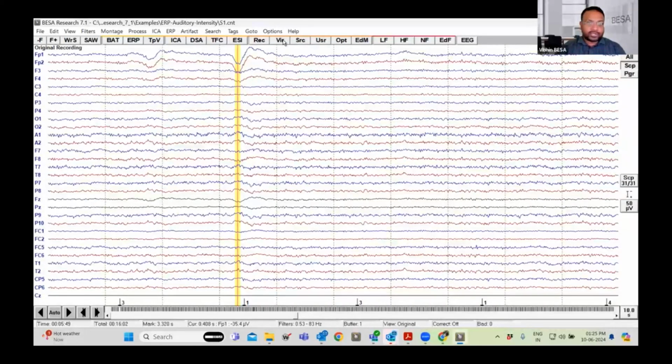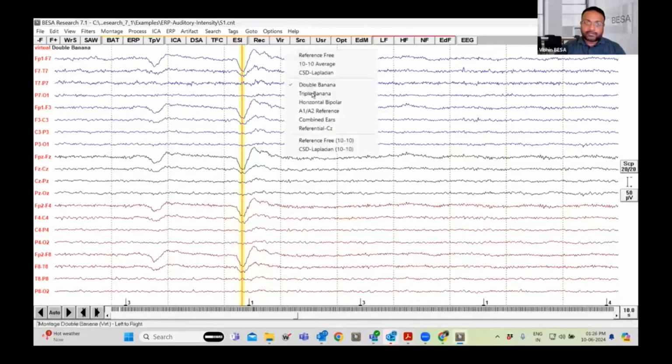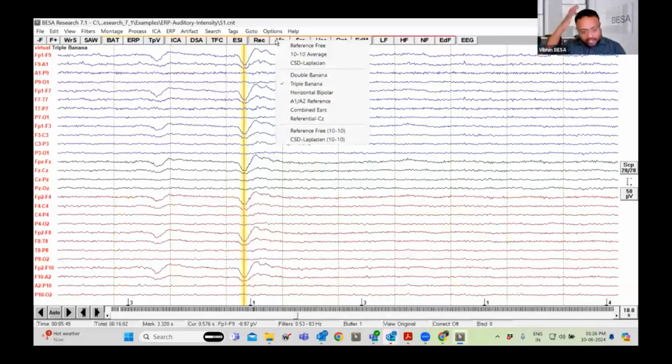This is the virtual montage, in which by default, this is a virtual triple banana. Which also has a few more extra channels, or else montage channels have been included into the montage. So if you know the classical double banana, you will know there are only a certain number of electrodes included. But with this triple banana, you have more electrodes included. So these virtual electrodes, the channels, have been virtually created to project the activities in those channels.